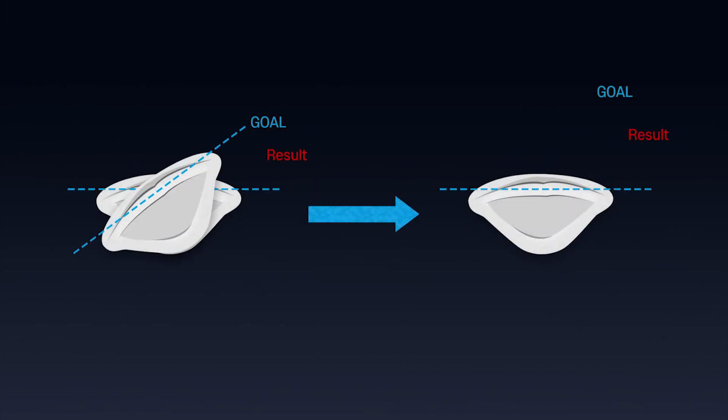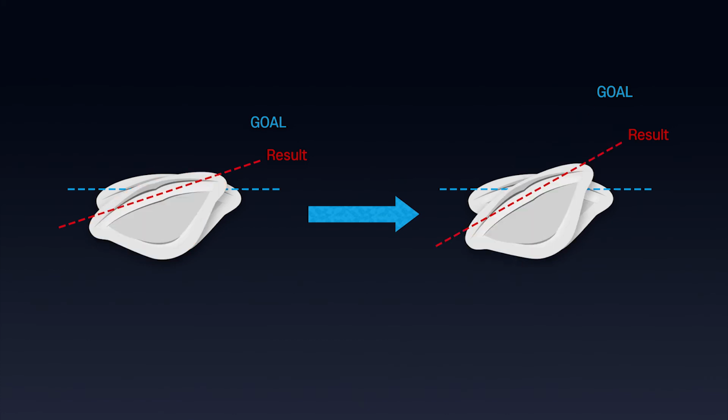If you proceed with the rotation setup at number 2 from the initial stage, you will get results of number 3. But if you apply overcorrection, you can get good results as shown on the right.